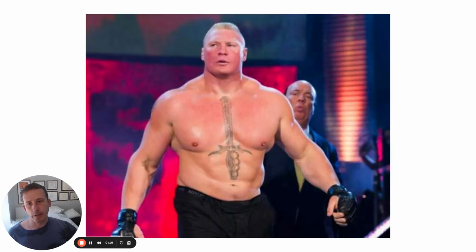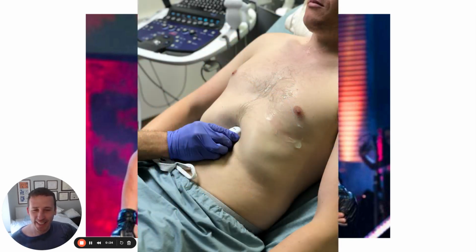This is Brock Lesnar, big fan of the sub-xiphoid view, and that's his manager who is impressed at his physique, I guess. So he loves it so much, he got a big brass knuckle sword tattooed where the probe goes.